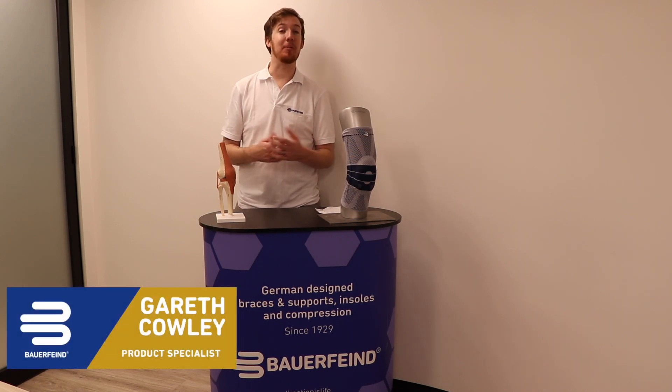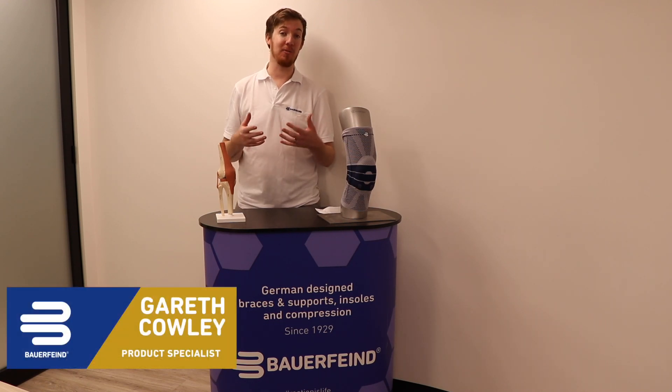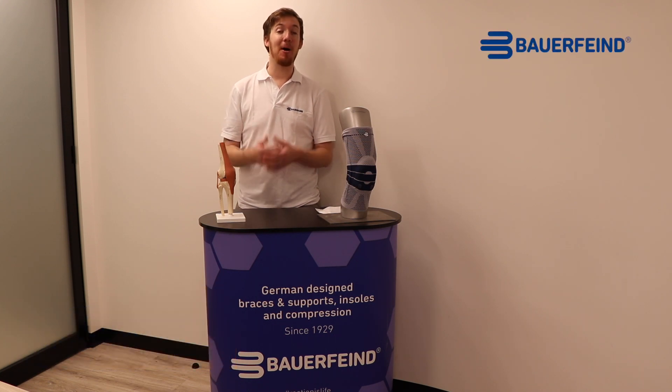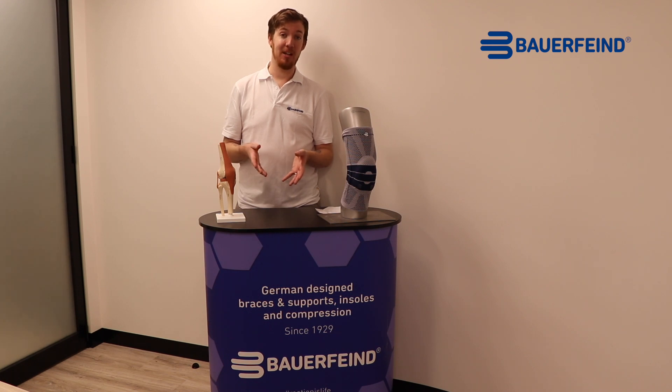Putting on a knee brace can be understandably confusing when there are so many different ones out there and you're not sure what's going to be most effective. But there's a simple principle for all of our knee braces which is the same: sliding it on and adjusting once it's there.